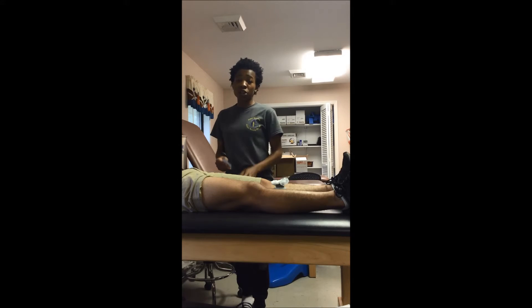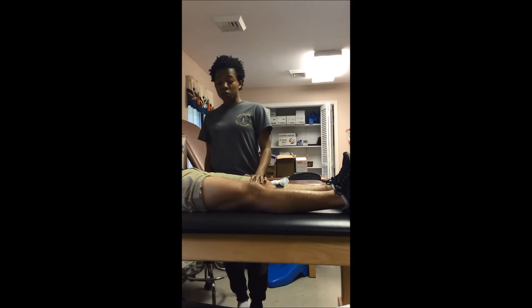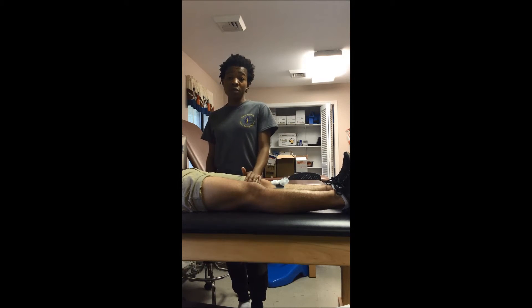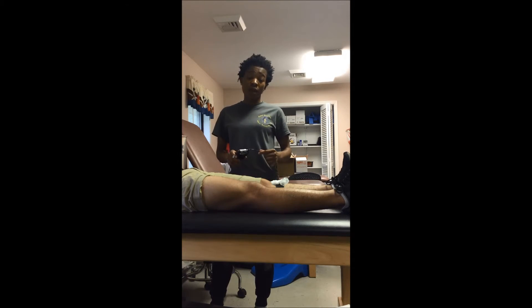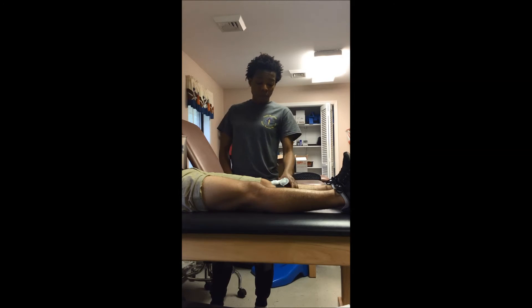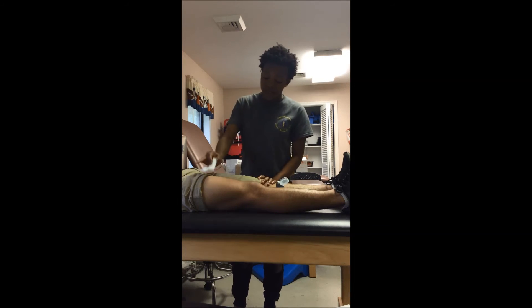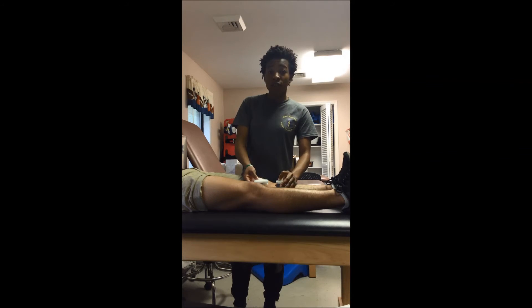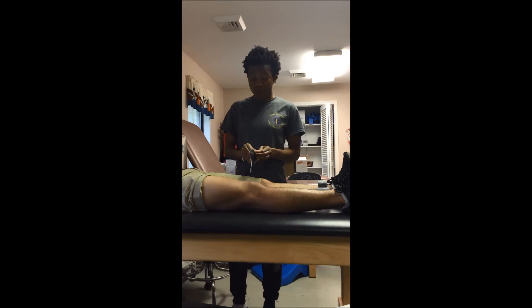Now I'm going to show you the application process of the TENS system. First of all, you want to make sure that your patient doesn't have any pacemaker or any contraindication that would prevent them from having the TENS system used on them. Then you want to make sure you clean the skin very well with alcohol so that it will reduce the skin resistance. Then you place the electrodes exactly on the trigger point.